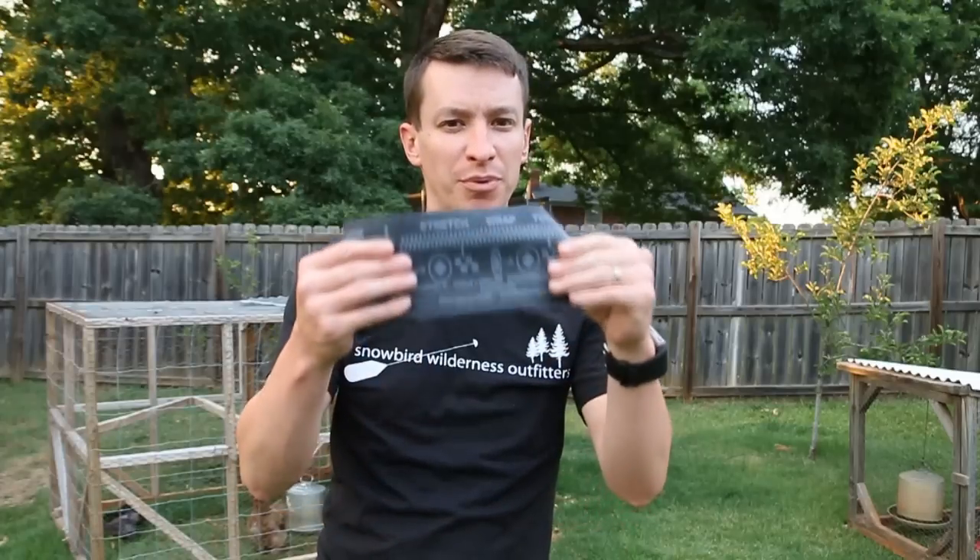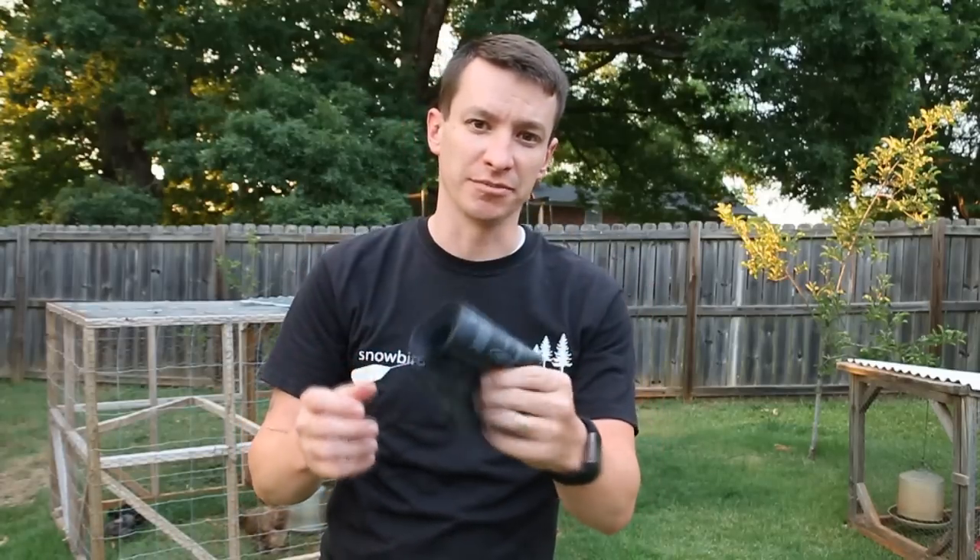Welcome to another video from Skinny Medic. I have the SWAT-T tourniquet here. I want to do a review for you, kind of give you the pros and the cons of this tourniquet.